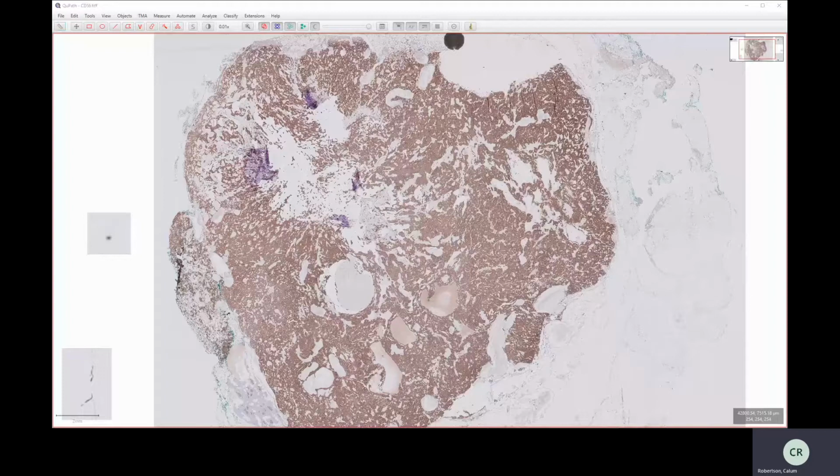Sometimes IHC is so effective that the diagnosis almost relies on it. I mean, we always use morphology, but sometimes IHC is really useful, and the diagnosis almost rests on the IHC staining. For example, on diagnostic biopsies in lung cancer, often deciding between adenocarcinoma and squamous cell carcinoma, it will all rest upon the IHC staining pattern. It's so useful and reliable in that circumstance.